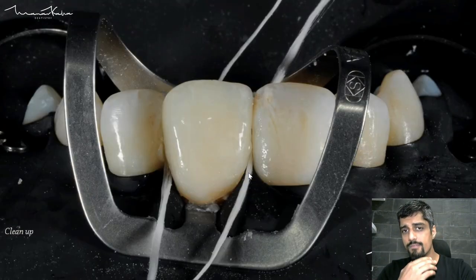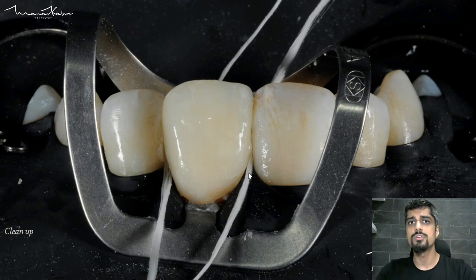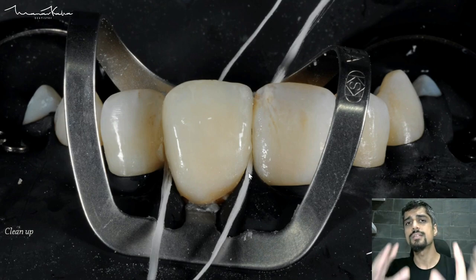You can see that I have placed the cement. Very important: clean-up. Please remember, resin cement is a double-edged sword. It's an excellent cement — it bonds, it provides very good aesthetics, and has high compressive strength — but it is very, very important to do a proper clean-up. Because even slight amounts of resin cement left in sub-gingival areas is going to cause massive irritation, and it's very difficult to clean once it completely sets.